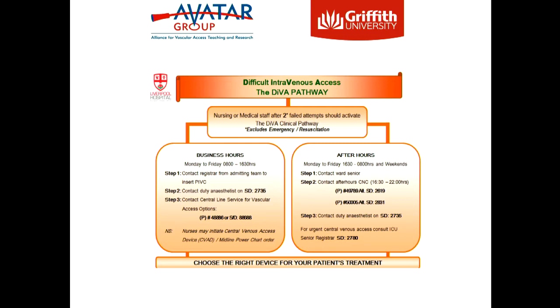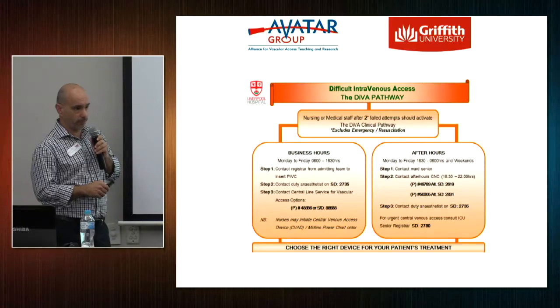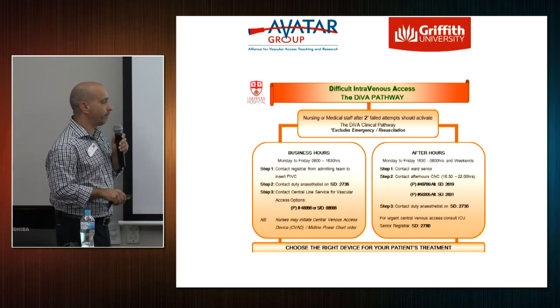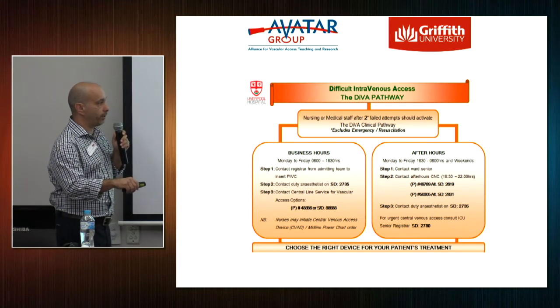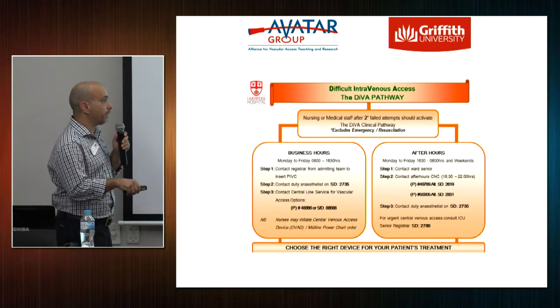Now, our after-hours CNCs at Liverpool found that they were forever being asked to try and cannulate difficult patients. So we sat down and said, okay, let's try and develop some sort of system. And we actually trained our after-hours CNCs in ultrasound-guided PIVs and midlines, predominantly to use for PIVs. And we had a bit of a pathway. During hours, if the patient was noted to be difficult, no more than 2 failed attempts should be done. If the patient was seen to be difficult, they've had a couple of goes, they couldn't get a cannula in, non-visible, non-palpable veins, the duty anaesthetist is to be called, and of course they're never available. So that falls to the central line service during business hours. After hours, if the ward senior is unavailable, then they contact the after-hours CNCs, who are trained up in using ultrasound-guided cannulation.